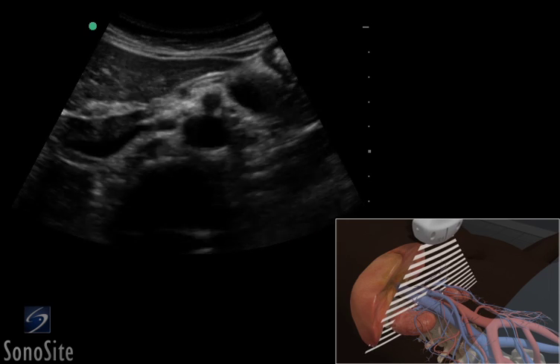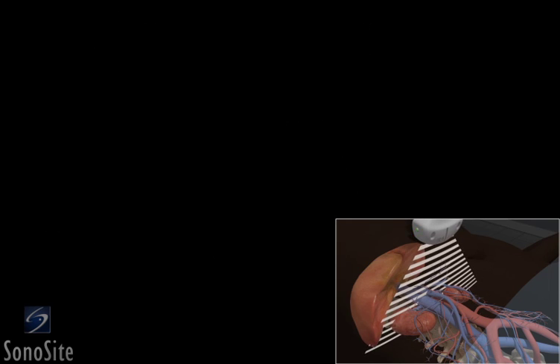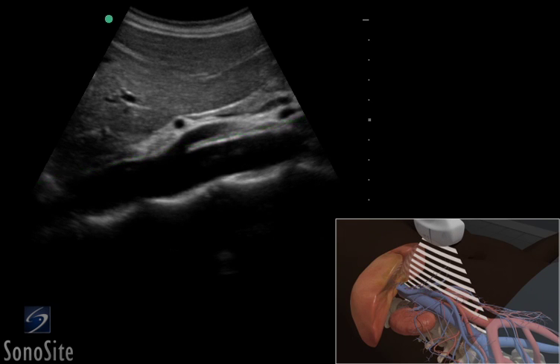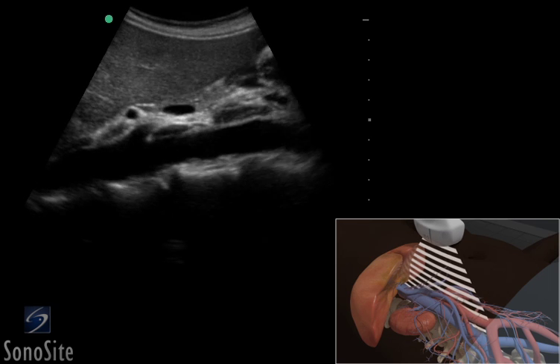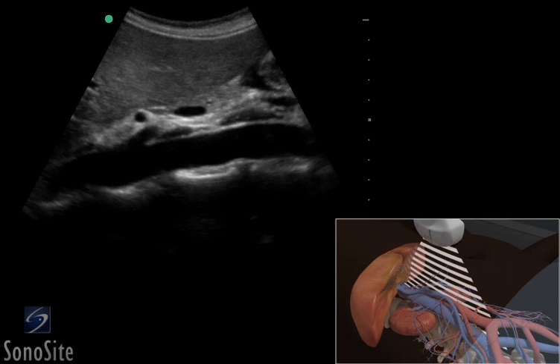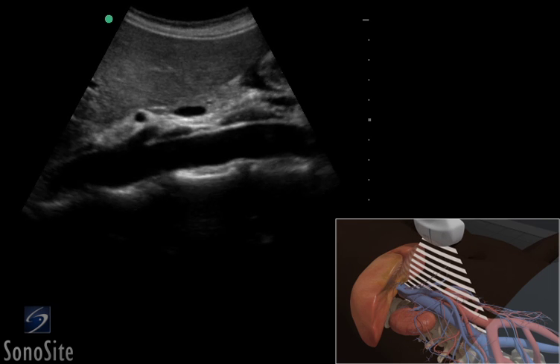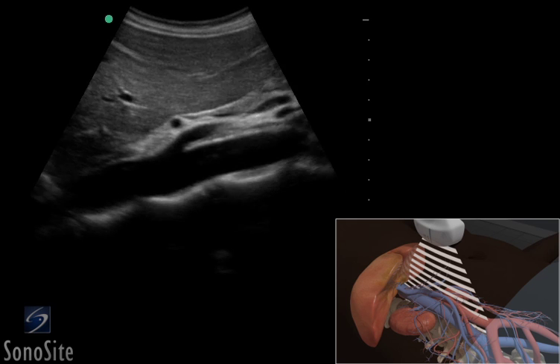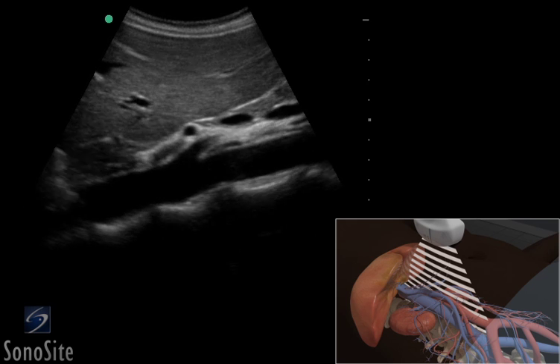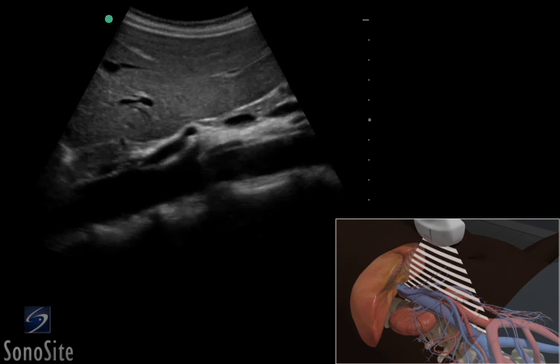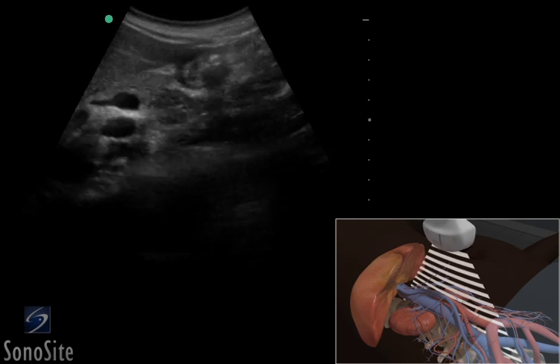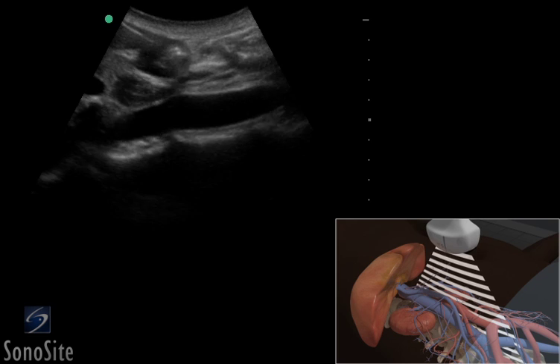The transducer is returned to the epigastric area and rotated 90 degrees clockwise with the orientation marker to the patient's head. The transducer is swept side to side to identify the maximal diameter of the aorta. The abdominal aorta will have proximal to distal taper. The transducer is moved distally to evaluate the walls of the aorta for any change in shape or size.